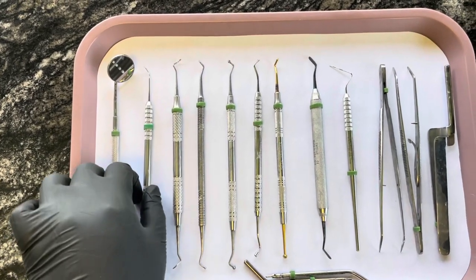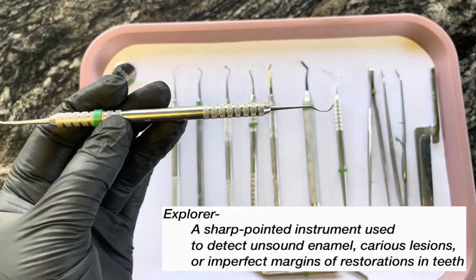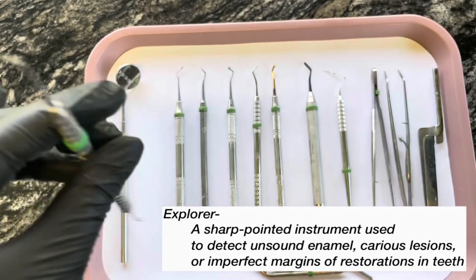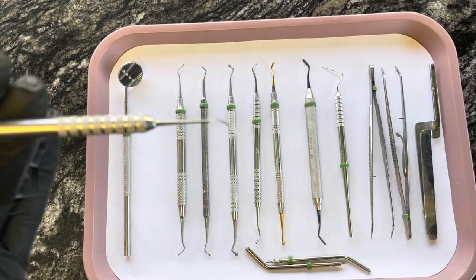So next we have an explorer. And this is used to check for any cavities and it's just pointy on both sides. This is called an explorer.